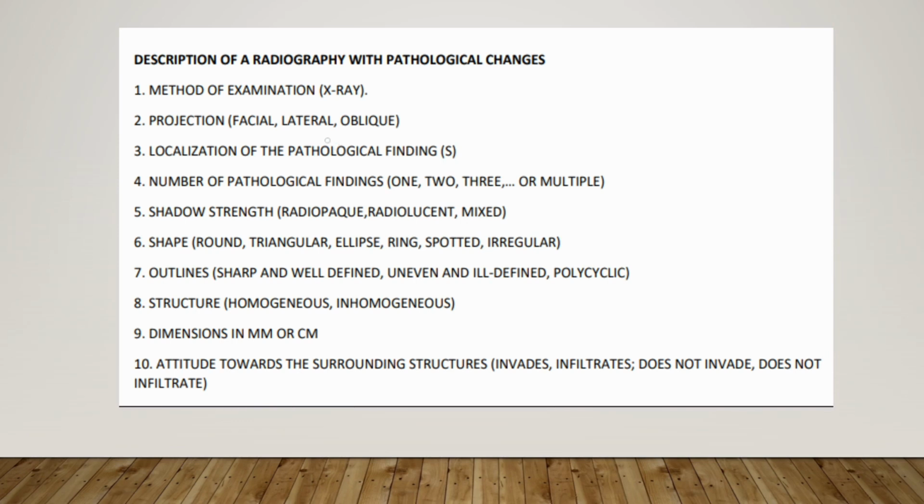Also with frontal, you should always do a lateral because you cannot tell if the lesion or the problem is on the front of the body or the back of the body. That's why you do a lateral with it. Okay? And oblique, I'm not too sure why you do that, but yeah, just focus on frontal and lateral. And there's another reason why we do lateral as well, because lateral can actually inform us of a problem between biliary problems and kidney problems, like a kidney stone maybe, or a biliary stone.